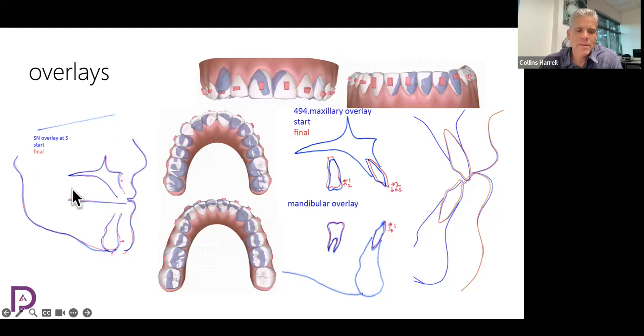Remember, aligners tend to deepen the bite by intruding the back teeth. So if the back teeth intruded, that would allow the position of the mandible to come up and forward just slightly, which may be why we see that here. I can't really account for any reason why the maxilla would come slightly forward, except for growth.